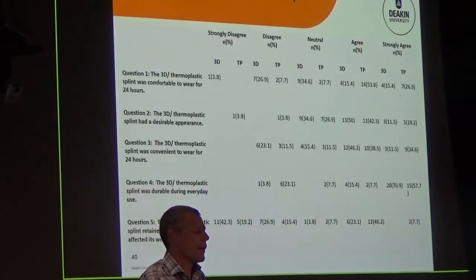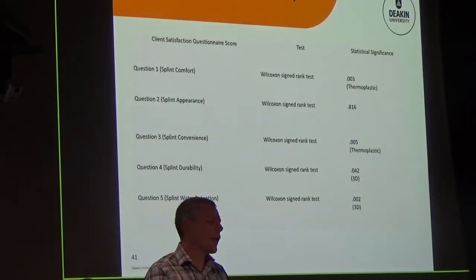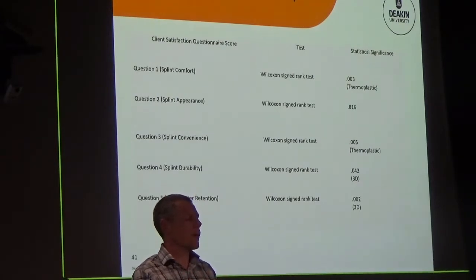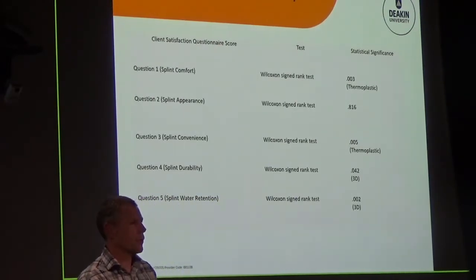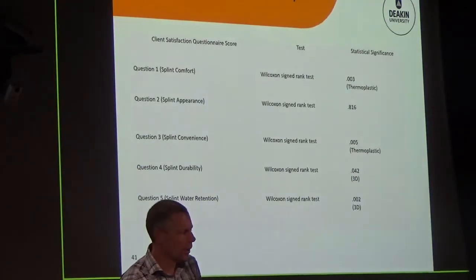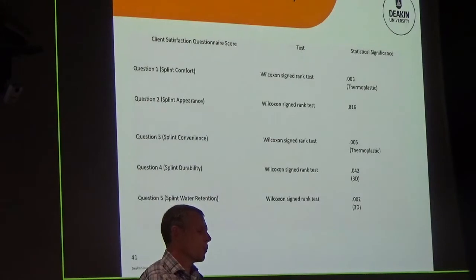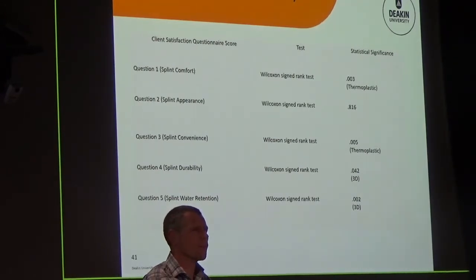And for the questionnaire that they completed, there's lots of figures there, so I'll just jump down to the statistical significant results. So for splint comfort, there was a result that the thermoplastic was said to be a bit more comfortable. The splint convenience, the thermoplastic was said to be a bit more convenient. The 3D was more durable, and the splint water retention, there was less water in the 3D splint, so less water getting stuck into the splint, all at a statistical significant result. Appearance, there was no differences between the two types of splints. There's some that like the 3D and some that like the thermoplastic in its appearance.